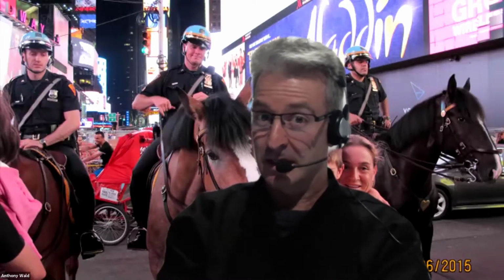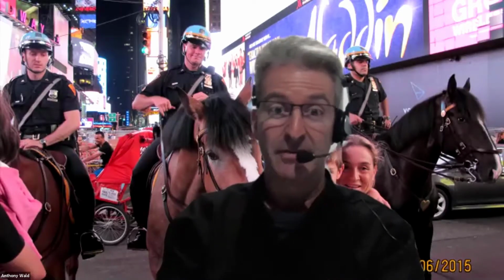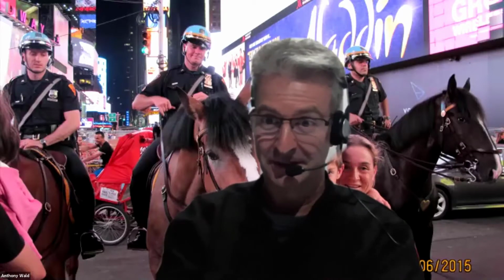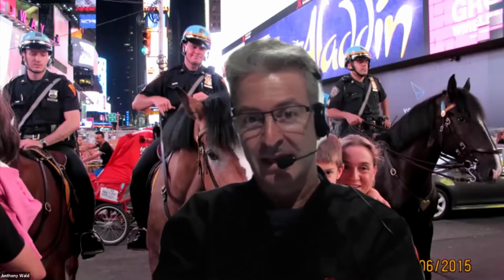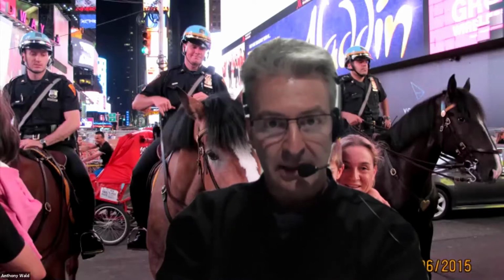In 24, maybe it's 25 years of scanning, I have yet to actually find a saddle PE on echo, which is really frustrating because I've had a couple of students do it after their first 2 months. So it really irritates me. That's how rare it is, I guess. Then the TAPSI and the 60-60, yep, I like that. I don't mind that at all.